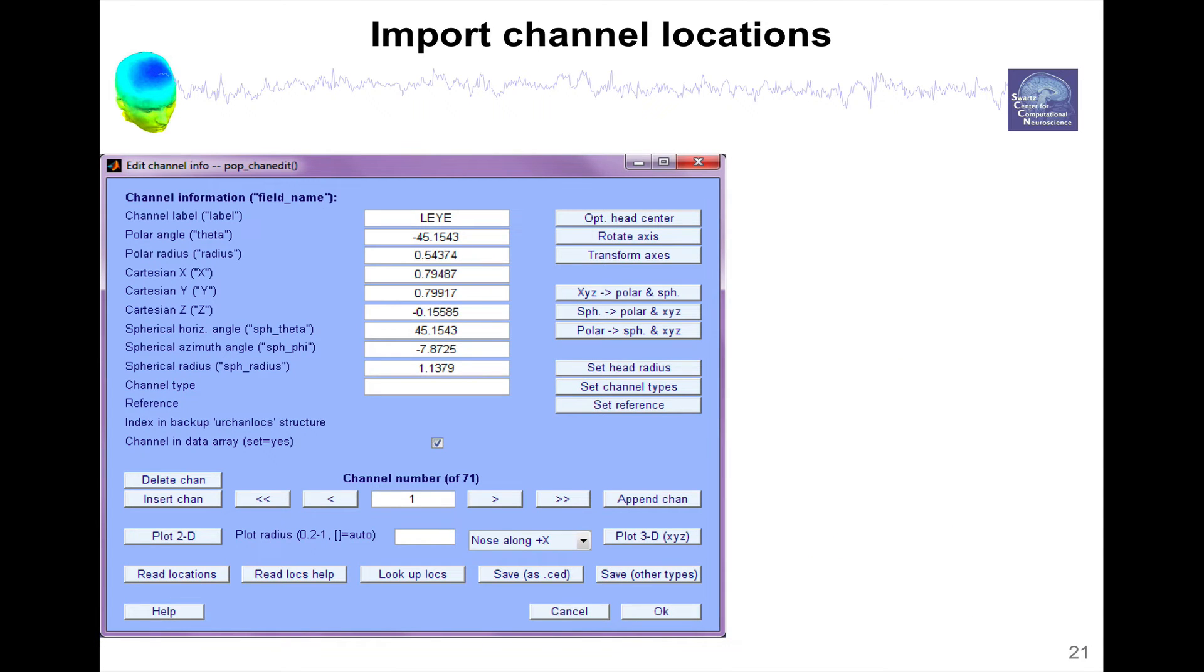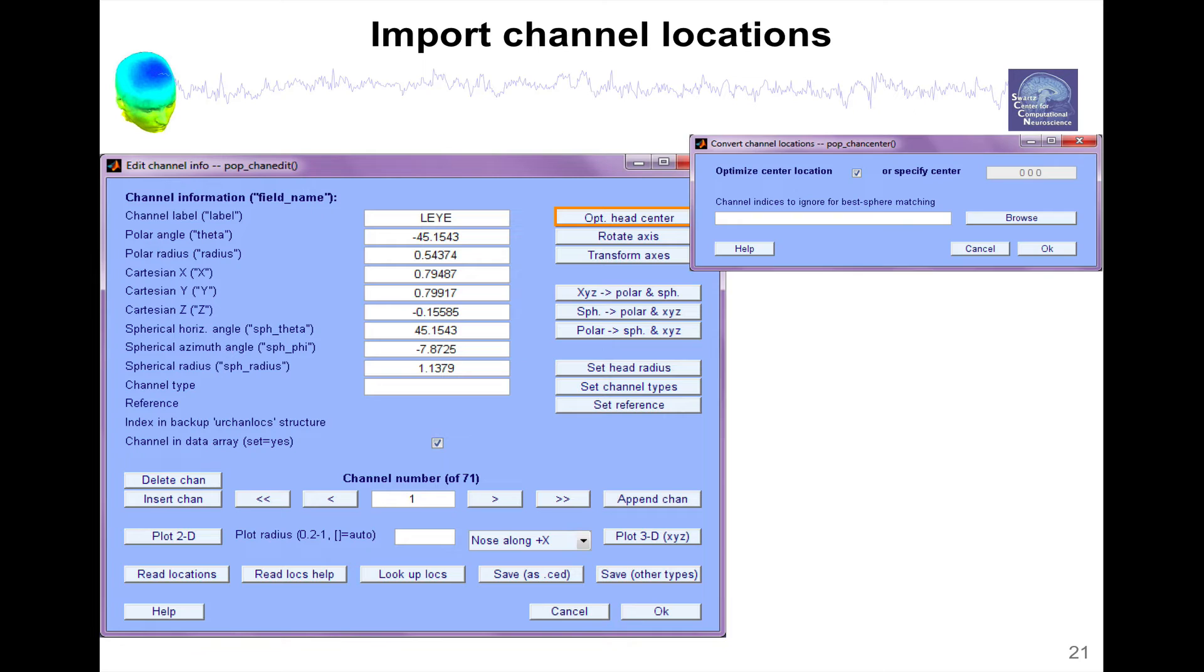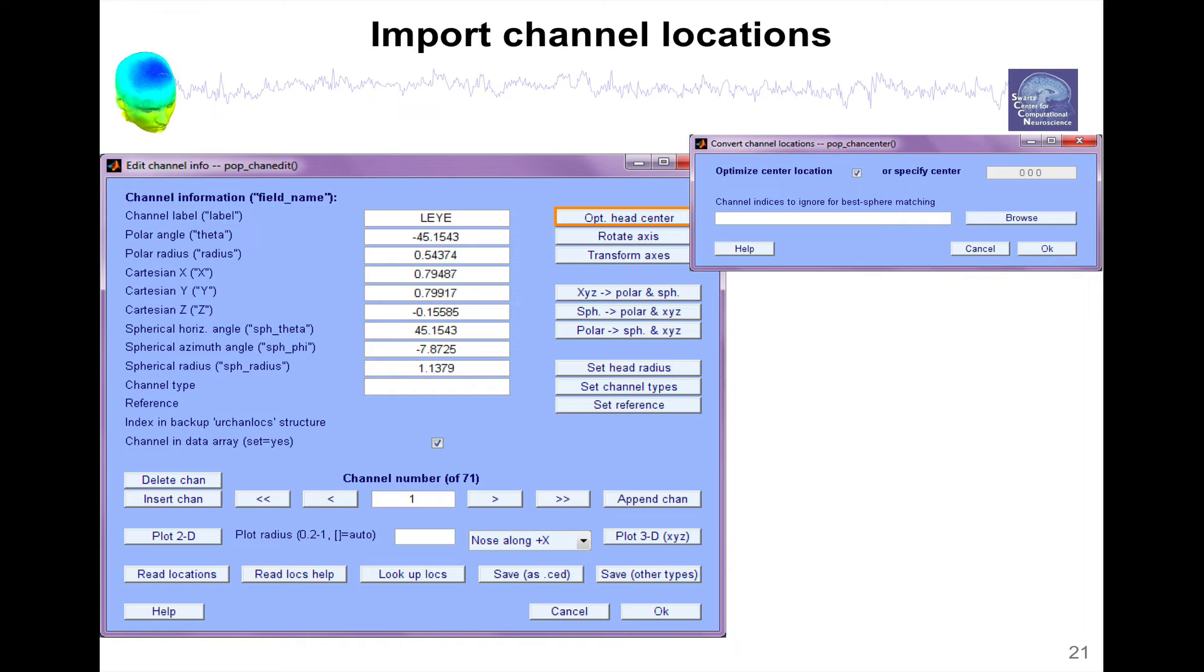If you import channels which you have scanned, you might also want to apply some transformation. For instance, you can optimize the head center. When you scan channel coordinates, very often the head center is not optimal. So you might want to select a subset of channels and fit the sphere. And then the new center is the center of that sphere. And you can exclude some of the channels when you do that.